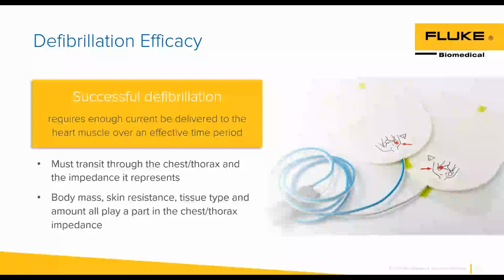So we have to ensure this defibrillator efficacy, where we want to make sure that the required amount of energy is delivered to the heart over the effective time period. So we're going to get this conductivity to the patient and it's going to actually do its job the first time. Things that play into this are body mass, skin resistance, tissue type.